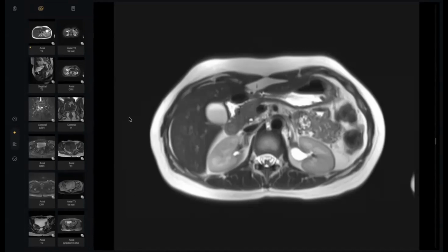My colleague, will the examiner give you abdomen and pelvis MRI? There are some things. Don't take it easy. He will not give you. Do you know in the exam he gave you almost 1 or 2 sequences. Even in CT, axial. Most of the CT, he gave you axial and limited study. He wants from you something in his brain. Either you will tell or not. No time for too much scrolling.